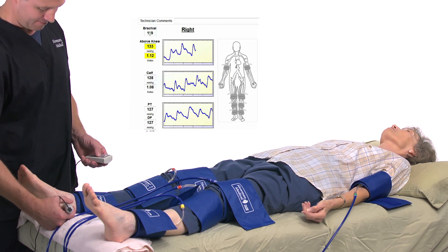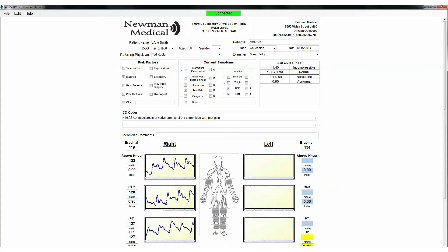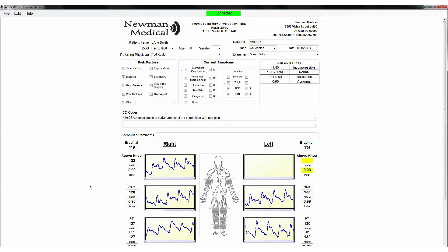When satisfied, push Next and the system will move to the left brachial field. Repeat this procedure on the left side. At each site, find a strong Doppler signal, press and hold Inflate until occlusion, and once blood flow returns, press Pressure. At the ankle and leg sites, also take a PVR waveform by pressing and releasing the button with the waveform graphic. When finished, you may add comments and select or add impressions if desired. Save or print the report by going back to the file menu.